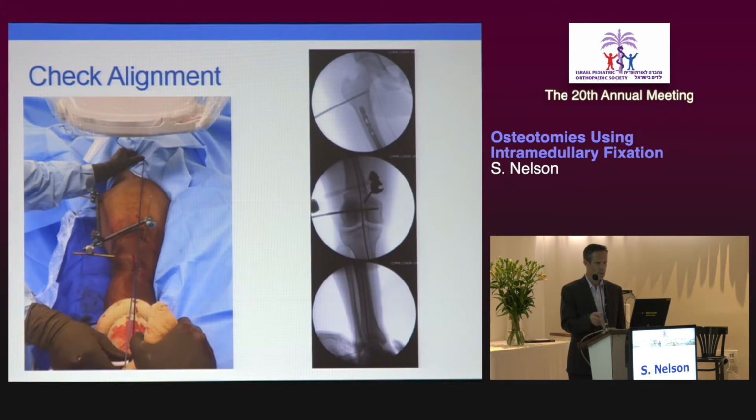And then once you've performed your osteotomy, you need to make sure you displace it in the correct direction if needed, and then you can place your fixator, lock it down, taking into account both the rotational and the angular deformity, and you can use your electrocautery cord to provide collinearity between the hip, the knee, and the ankle under fluoroscopic guidance.